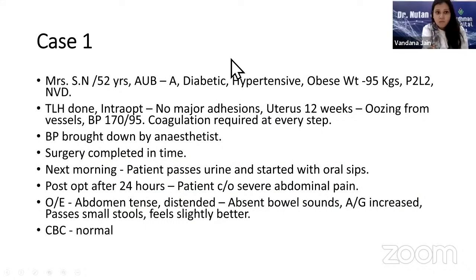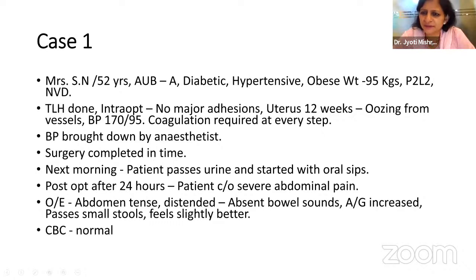Serosa can be left. Probably serosa can be left, if you're not reaching up to the muscularis. But only if there's a superficial serosal tear.